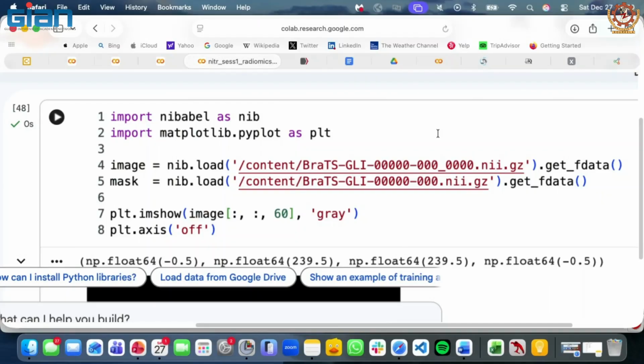If you pre-process them very well and use these 10-15 lines of code that I shared with you, extract radiomic features, and do some very basic statistics, I think that will be a very good analysis. And if you have a good outcome, where you can clearly see a difference in patients' features, that will be a very good finding for your class projects or master projects.